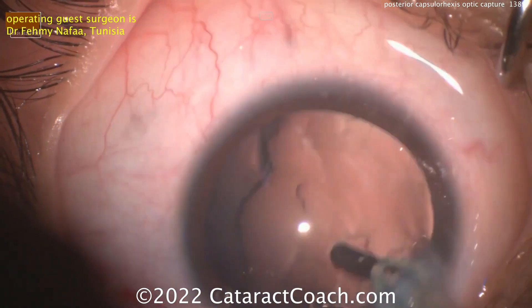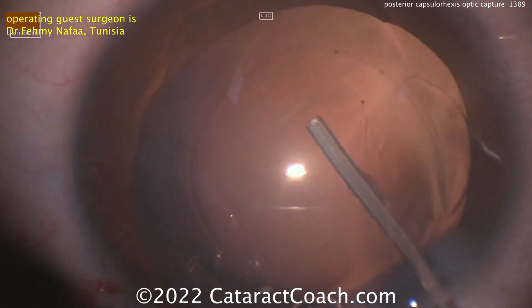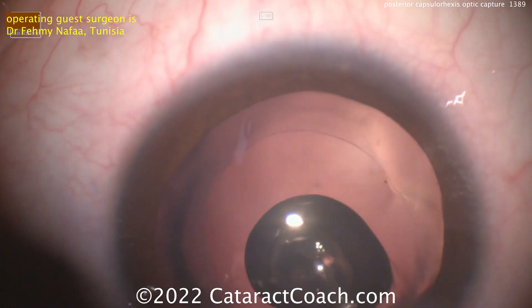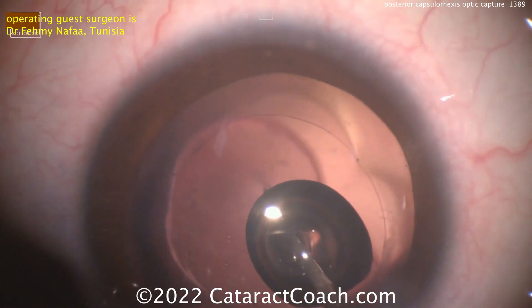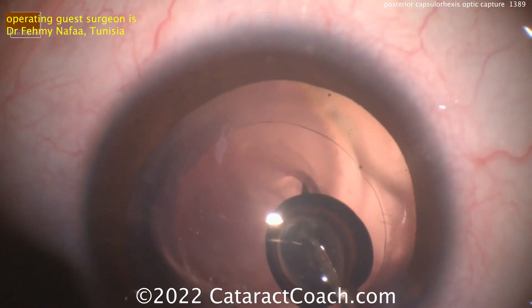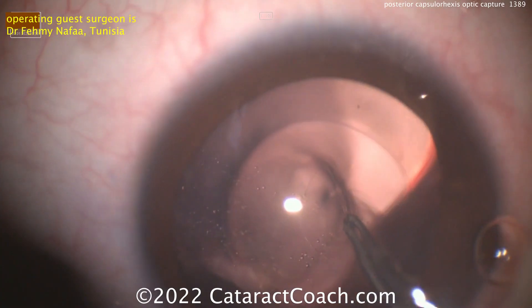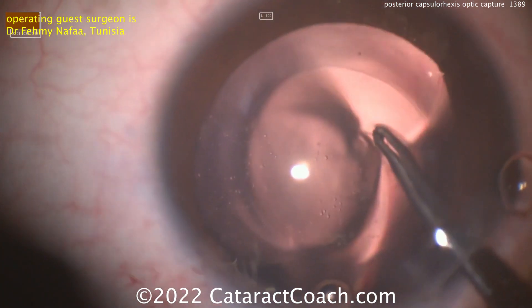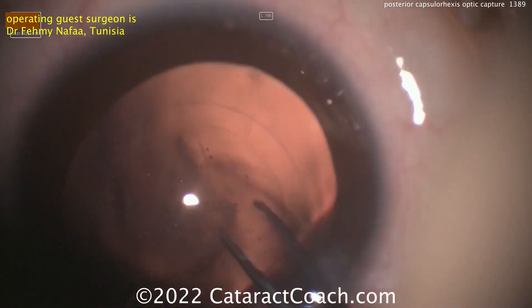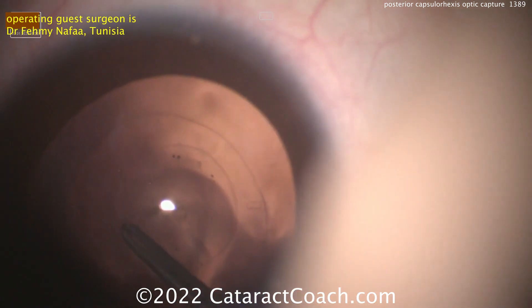The posterior capsulorexis is going to be done and the optic will be captured. You can have the haptics in the sulcus and capture behind the posterior rexis, or even have the haptics in the bag and capture the optic behind the posterior capsulorexis. There are a lot of different options, including reverse pupillary capture. What's happening here is making an opening in the posterior capsule and injecting viscoelastic to create a barrier between the posterior capsule and the anterior hyaloid face. Now the capsulorexis can be torn nice and carefully — that looks very nice. This is going to be a very stable fixation for a long period of time.